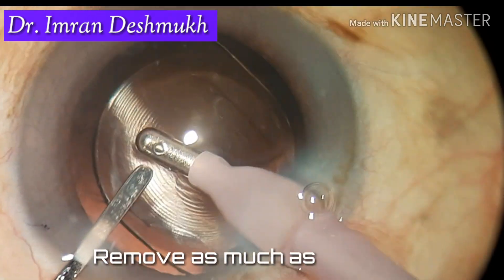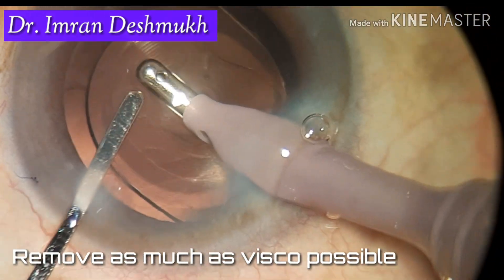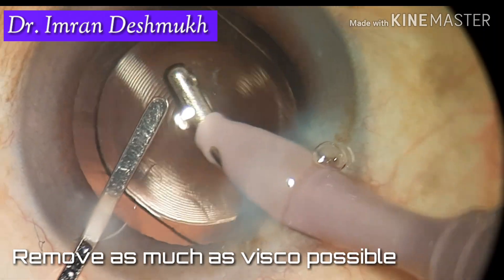Once the IOL is in the bag, introduce your IA probe in the anterior chamber and try to remove as much viscoelastic as possible. Even a little bit of residual viscoelastic can cause a significant rise in IOP spikes in the postoperative period, so it's always better to remove as much as you can. Be slow and be steady.